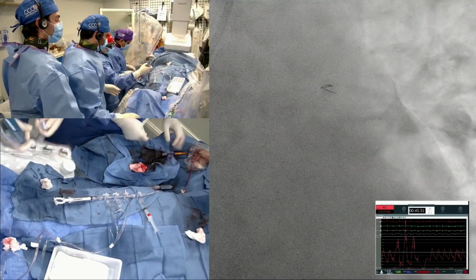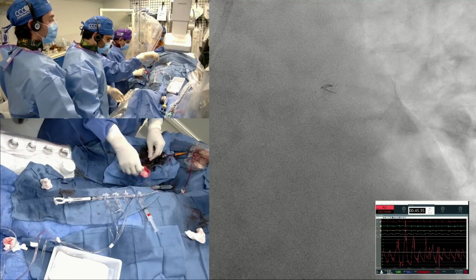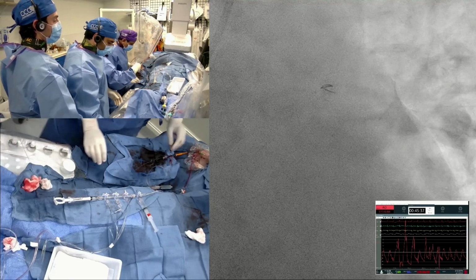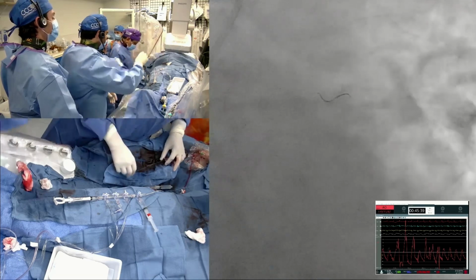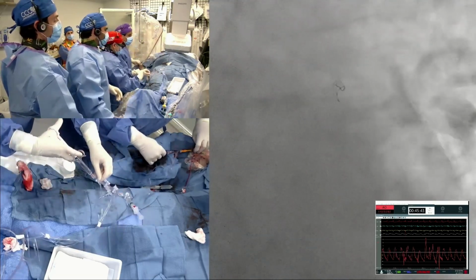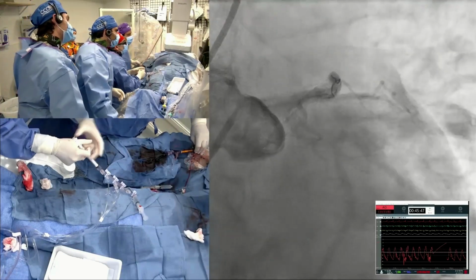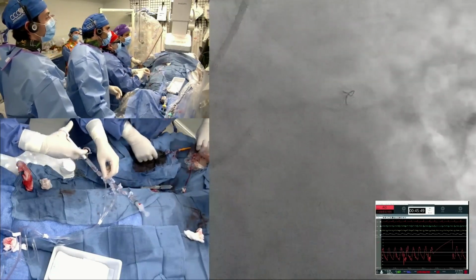And of course, we had to do a kiss. Once you do a 2-stent approach, always do a kiss. If you do a stent across, if it looks good, no need to do a kiss. Yeah, you need the Megatron just so you can see it through somebody with this kind of a BMI. Let's see, a little better guide.